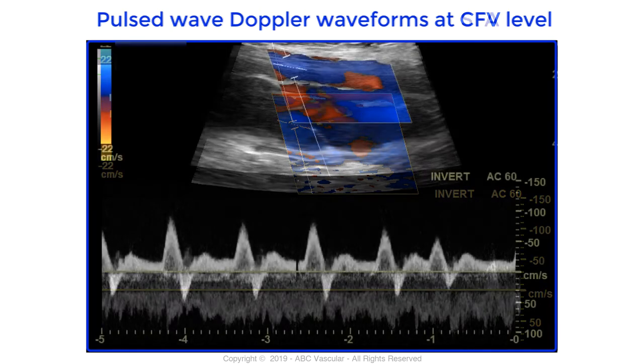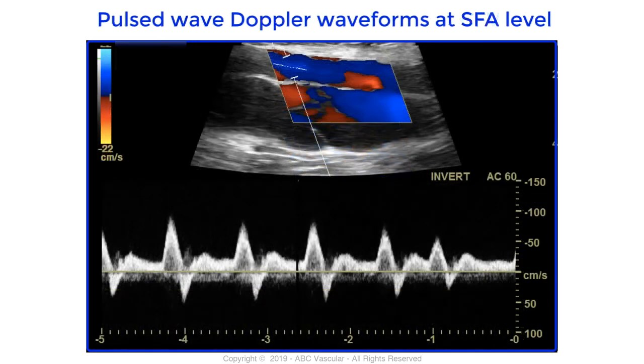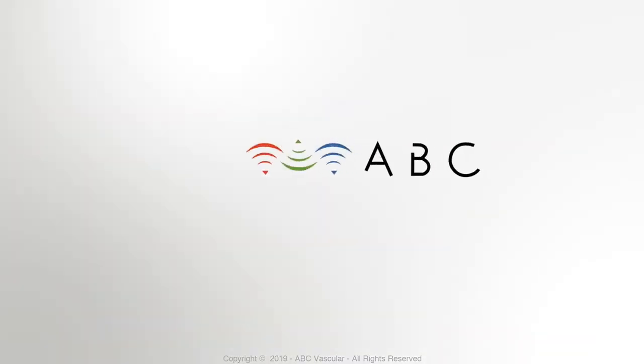The flow within the artery is of lower resistance, as demonstrated by a more prominent diastolic phase due to the presence of the arteriovenous fistula. Thanks for joining ABC Vascular Ultrasound.